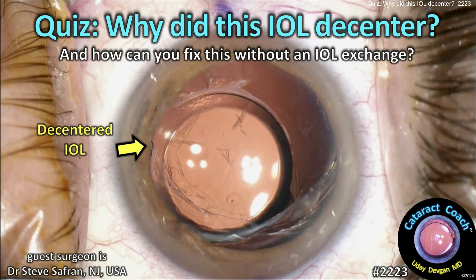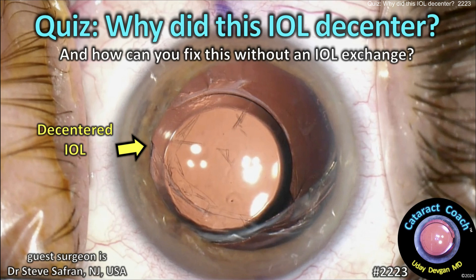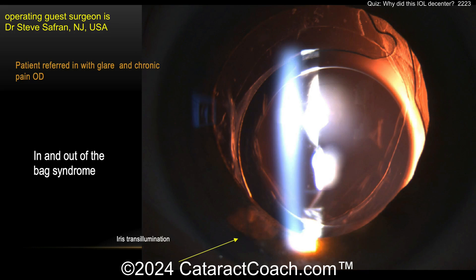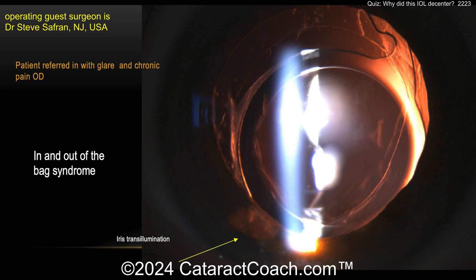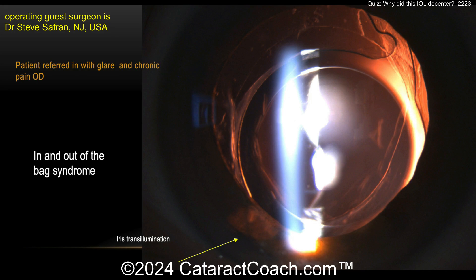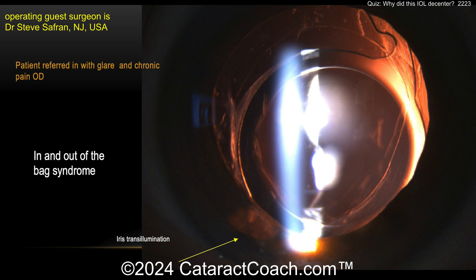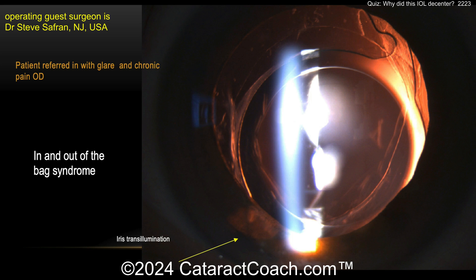Cataractcoach.com cataract quiz: why did this IOL de-center and how do you fix it without an IOL exchange? Here's the patient pre-op. It's in-and-out syndrome — one haptic in the bag, one outside the bag.